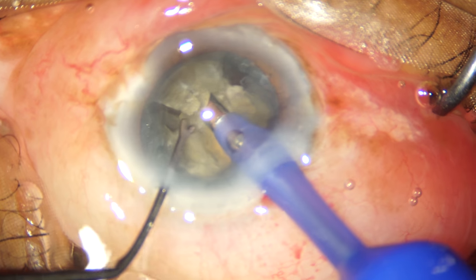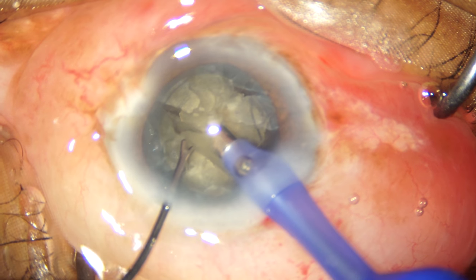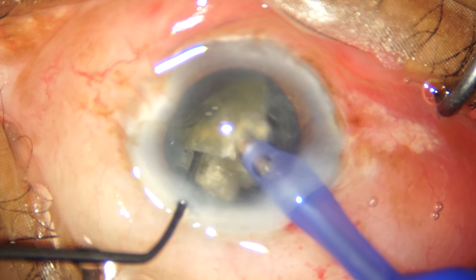You will notice that I'm using my Y manipulator as a chopper. I'm completing all the partial chops that I had achieved previously and I'm separating the nuclear fragments from one another with bilateral separation.